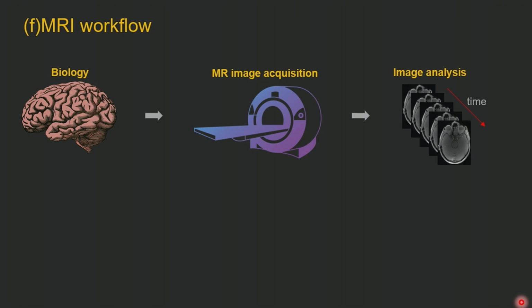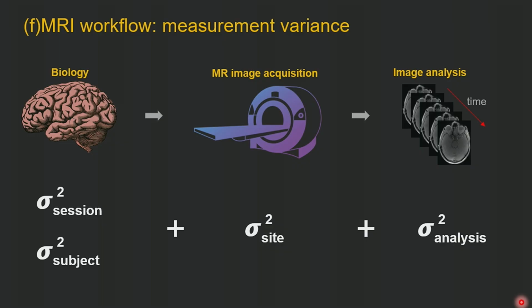All right, so we're here in some capacity because we like to do MRI, fMRI, right? We're studying biology, we're using our preferred modality, in this case, MRI, and then we're gonna do our fantastic analyses, maybe AI as the last speaker will talk about. But because this is a measurement, experimental science, we know that at each step along the way, we have potential for variance creeping into the process. So what I'm focusing on today is that variance that we're getting at the site acquisition level.